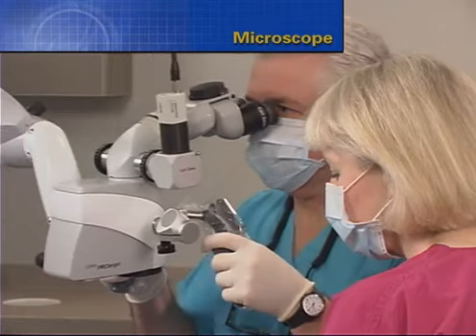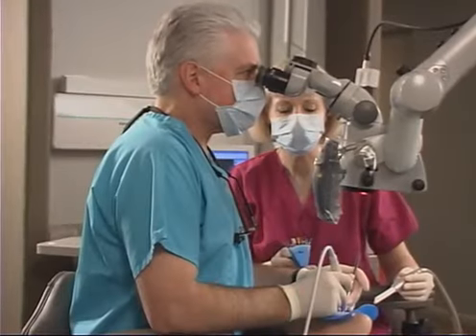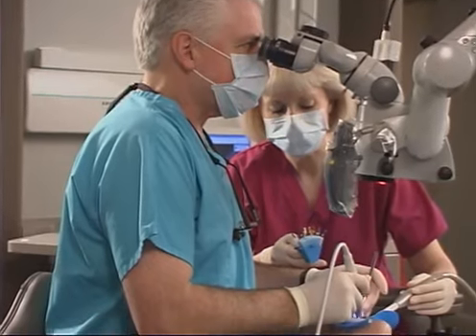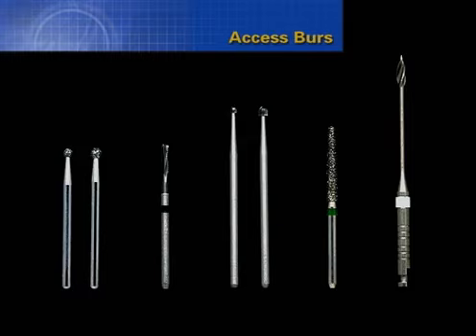The dental operating microscope provides unsurpassed vision when performing clinical tasks. Aside from remarkable vision, the microscope allows our posture to be correct, and we can work for extended periods of time. In endodontic retreatment, the clinician will require a number of rotary cutting burrs. In particular, the surgical length burrs move the head of the handpiece away from the occlusal table and provide unsurpassed vision when chasing missed canals.